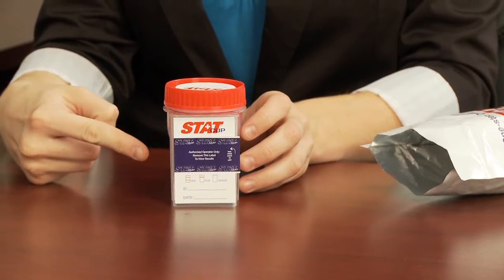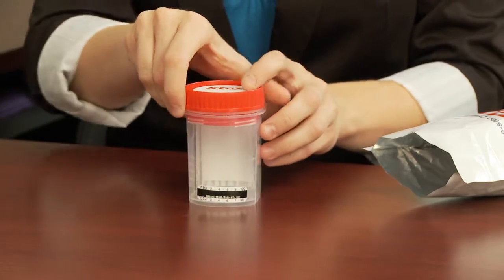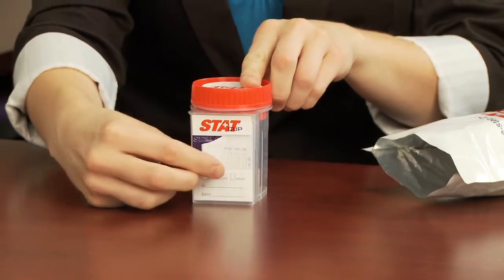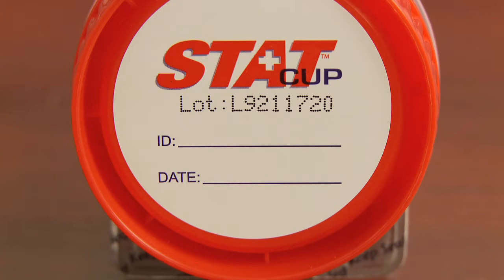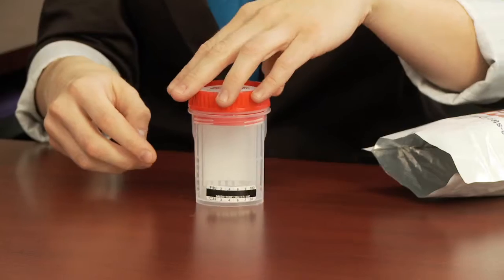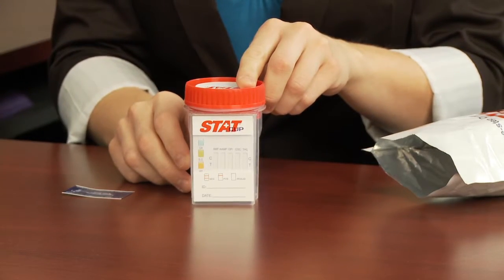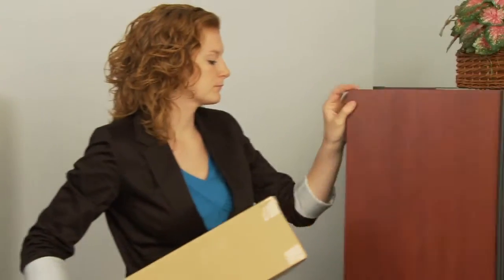Each StatCup includes an integrated collection cup and drug test device, a screw-top lid, and a liquid crystal temperature strip to verify specimen validity. Each test has a window where result lines will appear. StatCup tests include the following labels: a quick reference results key, space to enter the donor's ID number and the date on the cap and front of the cup, a gradient volume scale, and a minimum fill level line. A removable perforated label is also provided with each StatCup and is meant for the use of the test administrator. Each test strip on the StatCup is labeled with the abbreviation of the test substance.